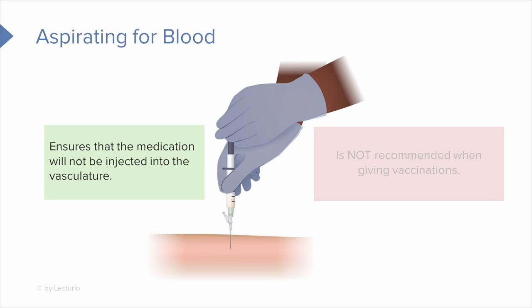Most injection sites don't really have major blood vessels present for this to be a concern. The other thing to think about is there's a little bit more risk if while I'm in the muscle I pull back on the plunger and then I've got to handle all this while trying to do the injection. There's more risk of moving that needle around in the patient's arm.